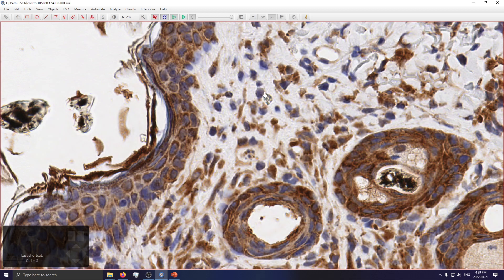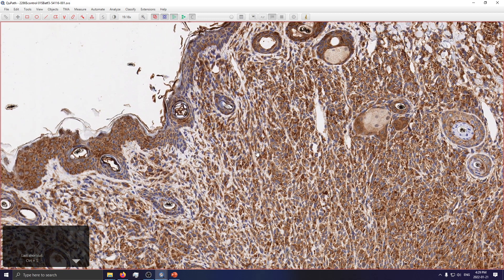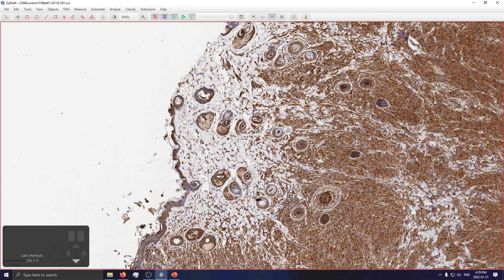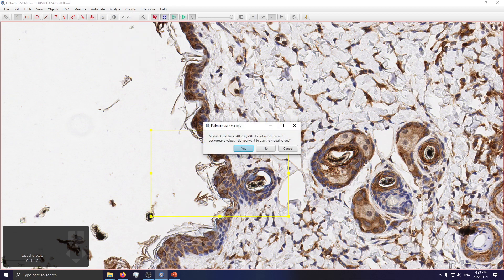Here's where I'll show some slightly more advanced stuff. Maybe a reviewer would ask: what does the brown staining look like by itself? This is a DAB stained image, so we need to isolate the brown stain. The way we do this is to tell QuPath what pure brown is, what pure hematoxylin is, and what pure background is. Rather than manually setting the values, we can do it automatically: select a small area containing representative colors of all of them using the rectangle selection tool to draw a rectangular annotation. Then go to Analyze > Pre-processing > Estimate Stain Vectors.